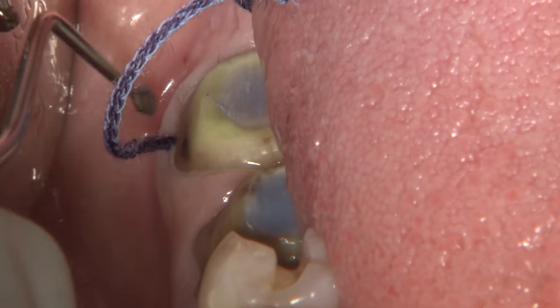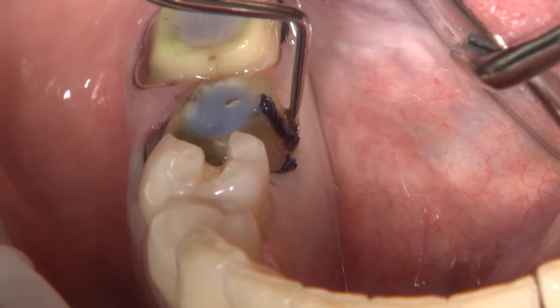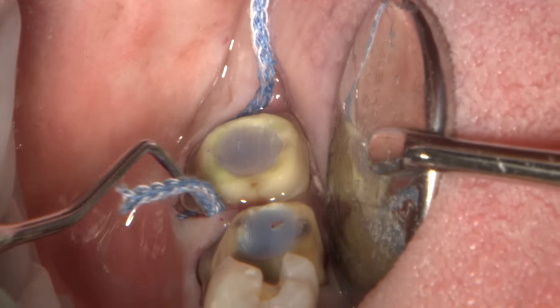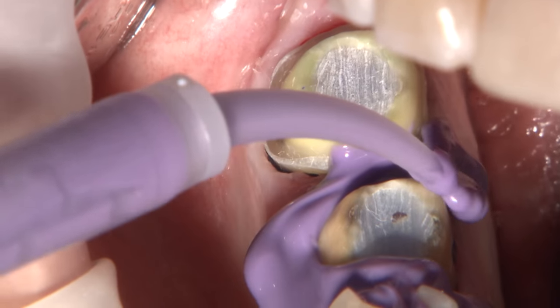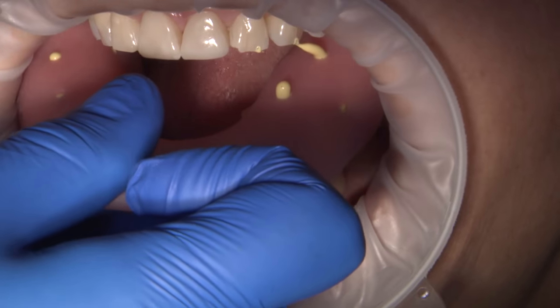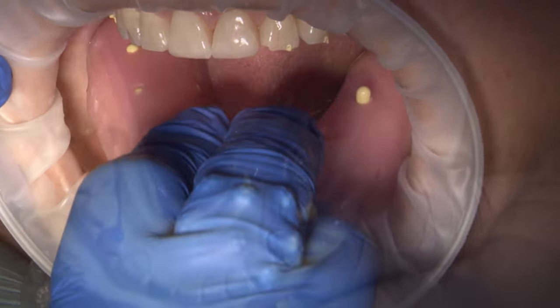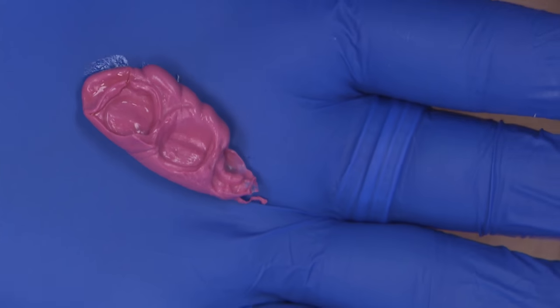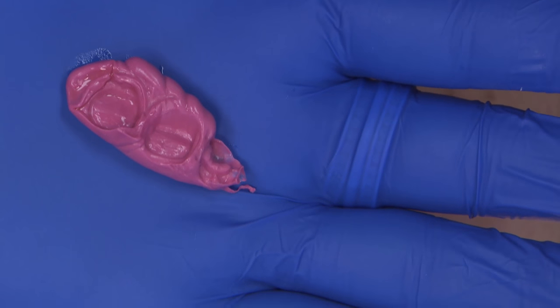The final impression is taken in a similar way as we did for the left side, utilizing the double cord technique, providing mechanical displacement of the gingival tissue, enlarging the sulcus and allowing access for the light body impression material. Again, a full arch impression along with bite registration will be provided for the lab to minimize occlusal errors.